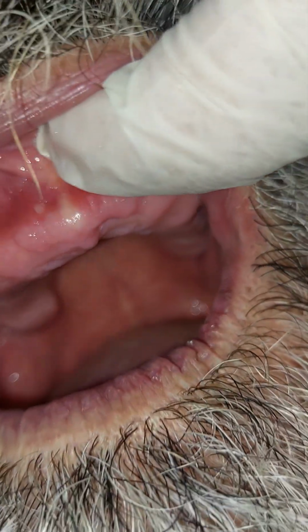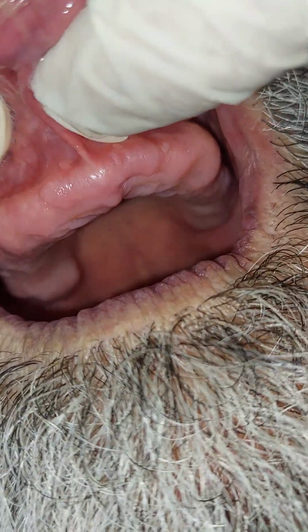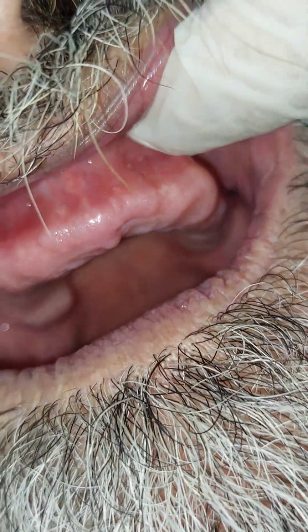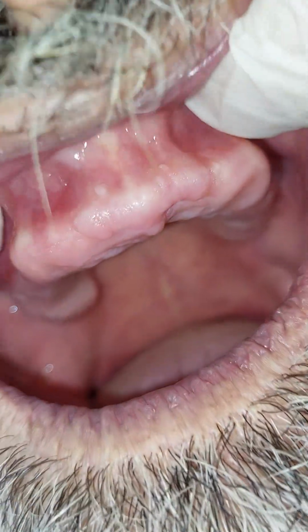Once more, in this case, if I do a lot of relief in the denture, we will have a lot of space between the tissue and the denture, and the hygiene should be meticulous for these patients. All of these are options on how to deal with undercuts at the denture level. The previous video talked about the impression level, and before that the primary impression, and the reasons. But this video concentrates on the solutions.